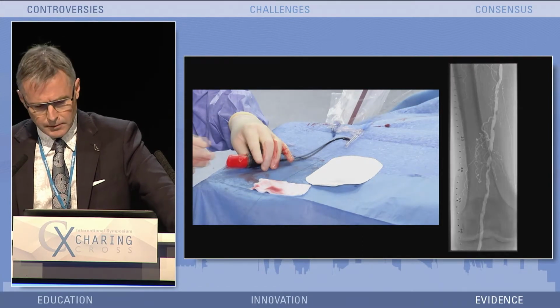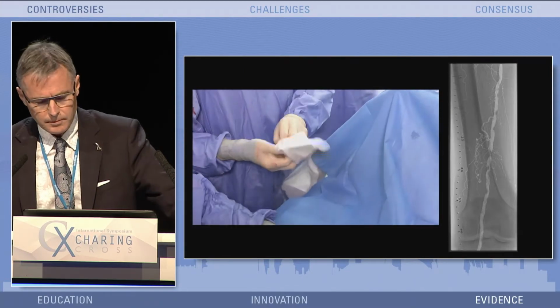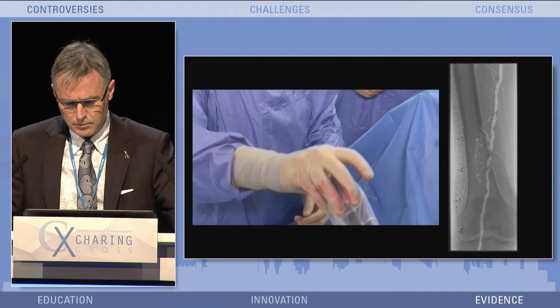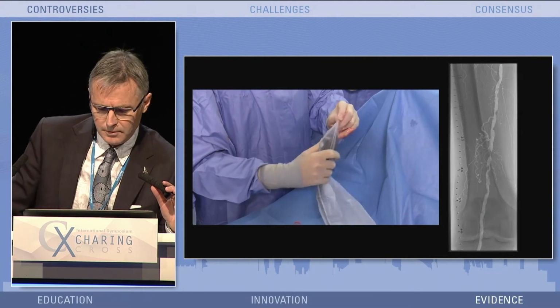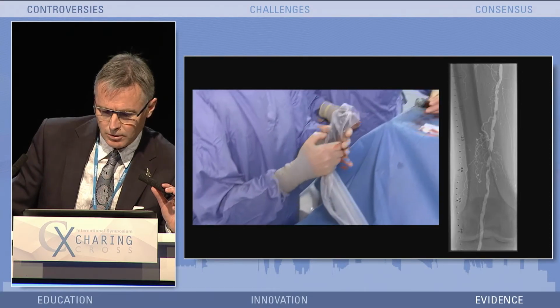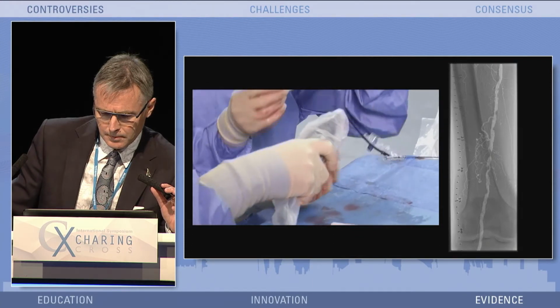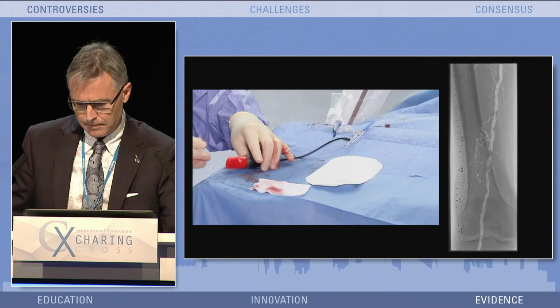lithotripsy. So we're going to now connect the generator. And to do that, we just use a sterile ultrasound probe cover and drape that over the generator. I like to create a little bit of redundancy in this, and then we just cut the tip of that. There's obviously different ways to do this. This is just the way we do this. We're now advancing an unsterile tip of the generator, but connecting, re-advancing, and then securing to keep sterility, the generator connected.